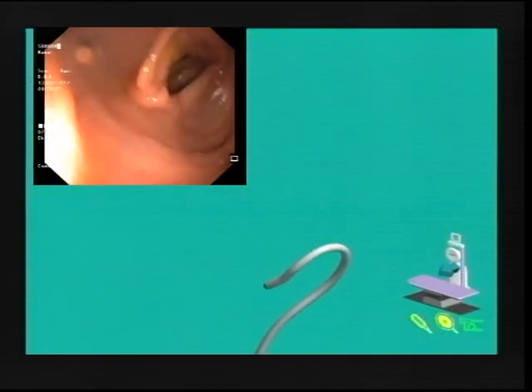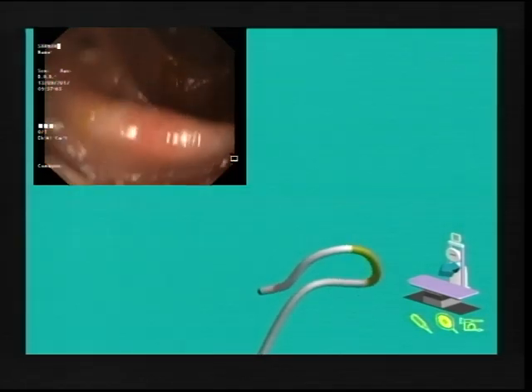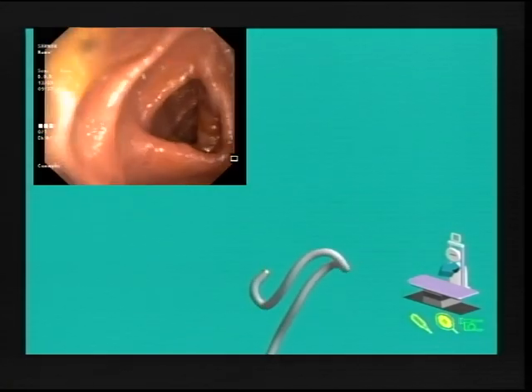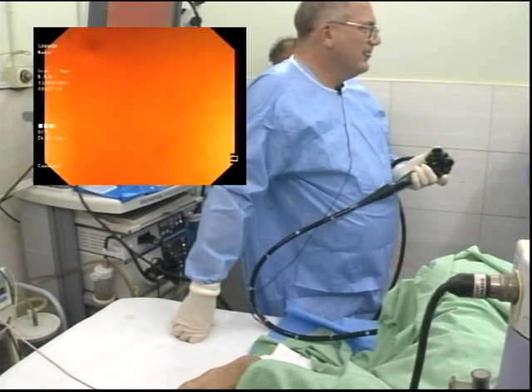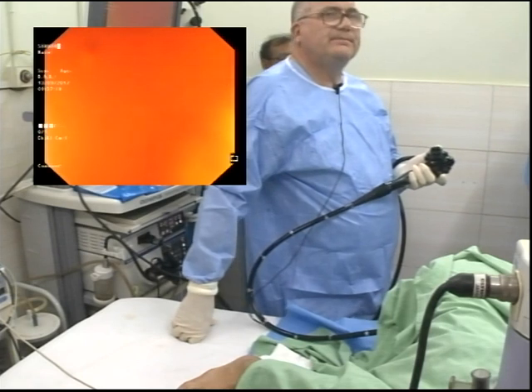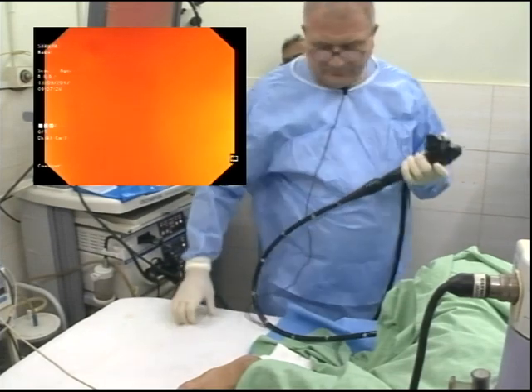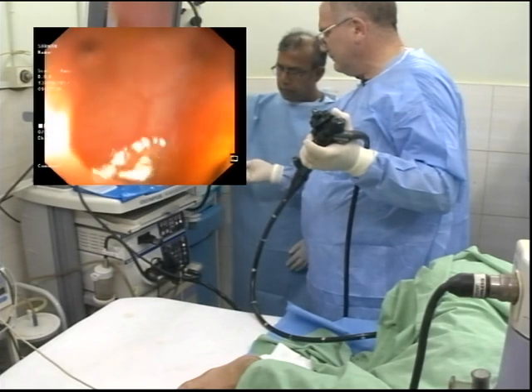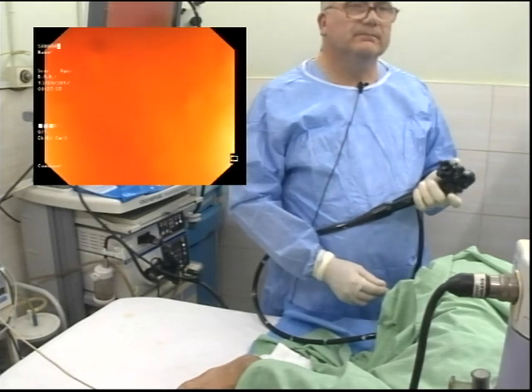Suck. And that's not suck to hold, that's rubbish. What it is actually for is to collapse the bowel so you can advance safely. Okay, Paul, just hold, stop there. Freeze. What he's saying is that he goes forward and then pulls back. That way you keep the scope straight and shortened all the time. And like he just showed, if he hadn't been careful and slow, you could have easily created another problem there. When you pull back, you see the lumen and then you move forward. When you move forward, you pull back your scope, making sure there's no extra scope and keeping straight.